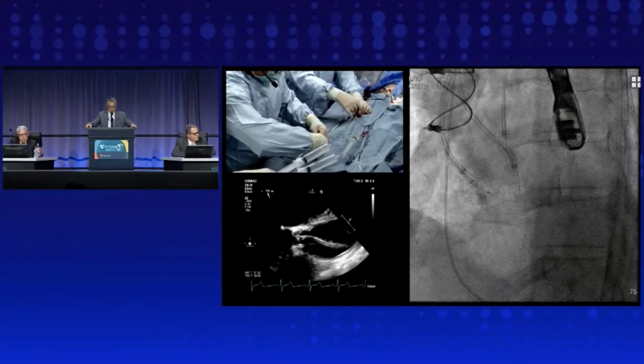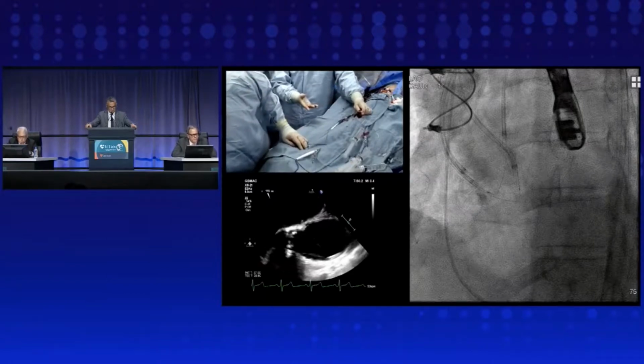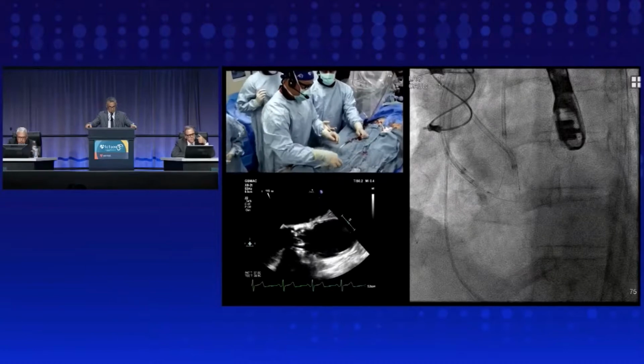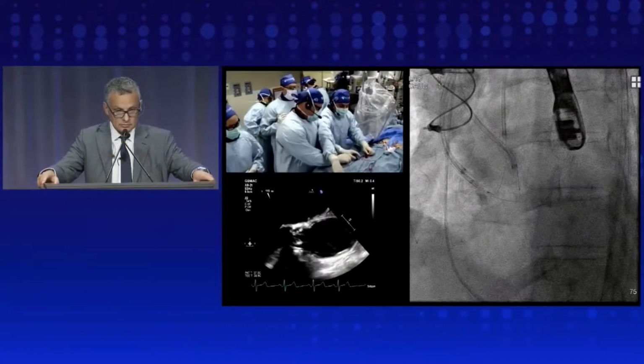He's breaking a calcified valve. Any issues that you... Well, yesterday we had a severely stenotic valve, and two days ago, severely calcified valves. Both of these traversals were similar, and certainly the Lampoon experience was similar.